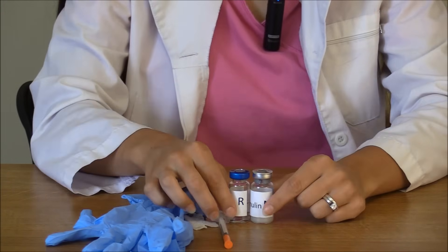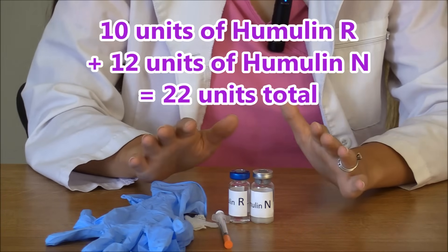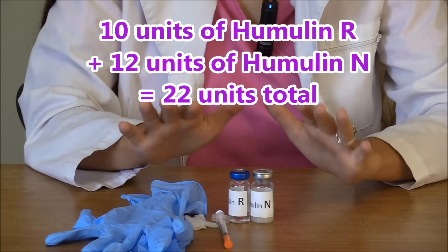You need to ask yourself how many total units of insulin you're going to be giving. That's 10 units of humulin R and 12 units of humulin N, so that equals 22 units total.